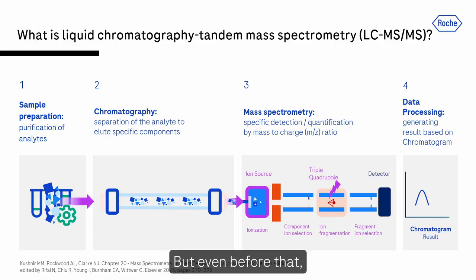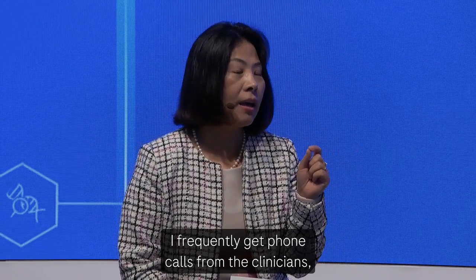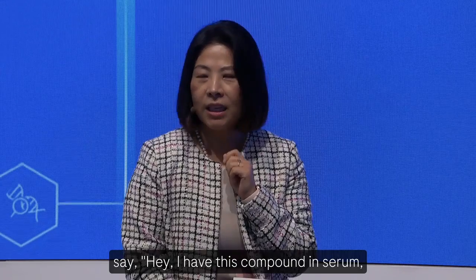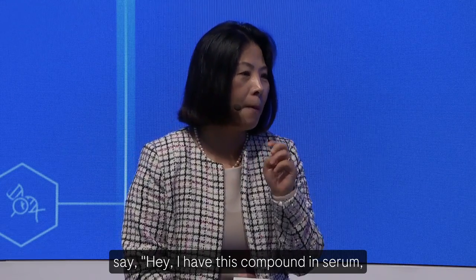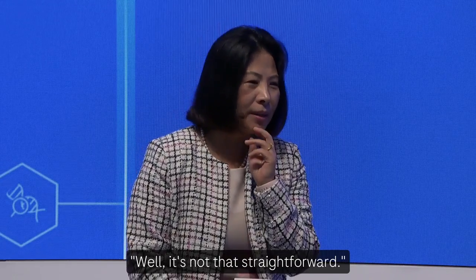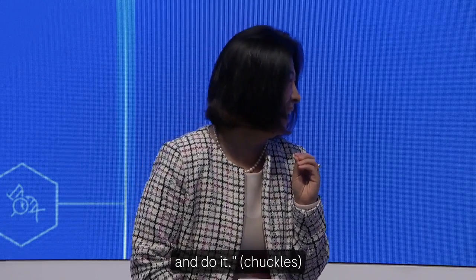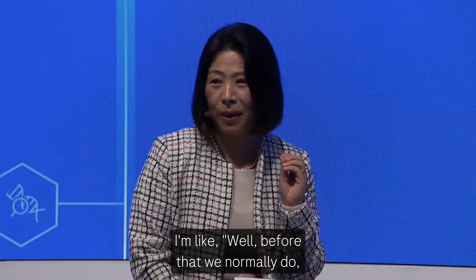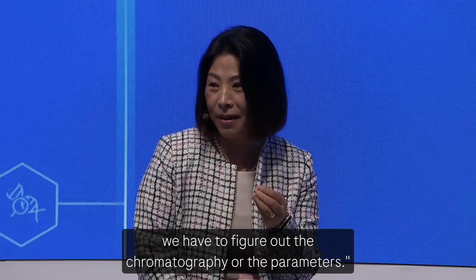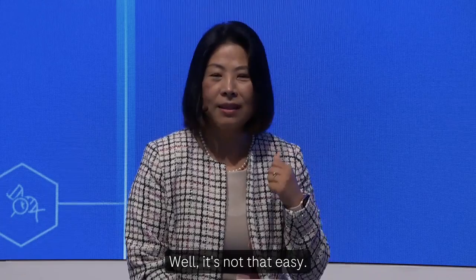Even before that, there is what we call sample preparation. I frequently get phone calls from clinicians saying, I have this compound in serum, can you measure that for me? I tell them it's not that straightforward. They say, you can just shoot it into your mass spec. But before that, we normally do preparation, and we have to figure out the chromatography and all the parameters. Most people think they can just inject something, but it's not that easy.